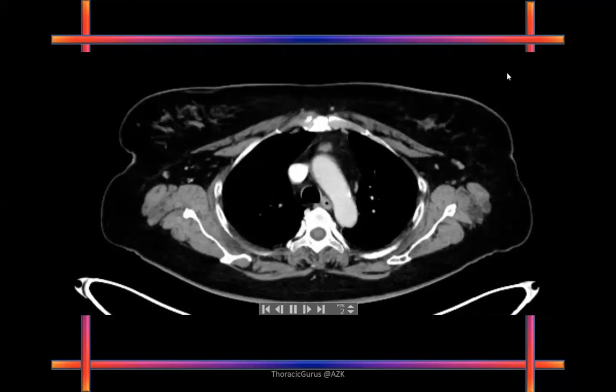Okay, what is the structure that is highlighted? That's the SVC. Excellent. Good. Everybody happy with this? So far, so good? Yes, sir. Continue looking at the SVC, okay?